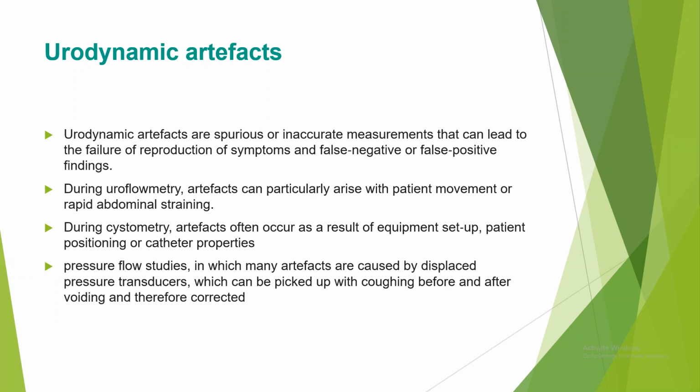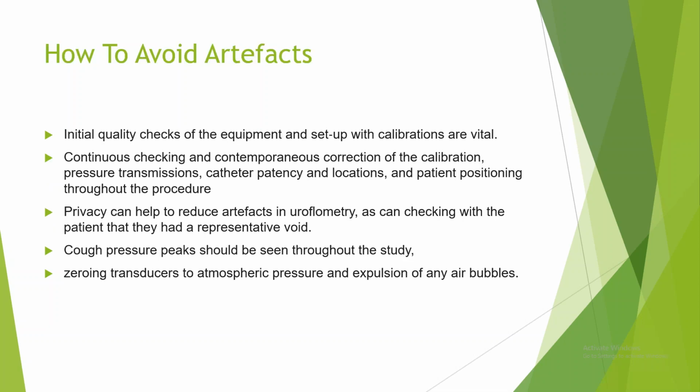While during the filling phase, it is because of the catheters and pressure transducer changes. Most of the time during the filling phase, the artifacts are due to catheter position changing, drop of the catheter, or recording of rectal contractions. Spontaneous rectal contractions can also be seen, which show as a rise in the abdominal pressure. In Urodynamics there is a big table on artifacts. No need to memorize that table by heart. You should only know what artifacts are, when they can be found, and how we have to correct them.